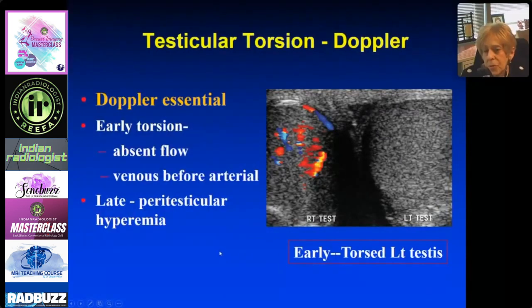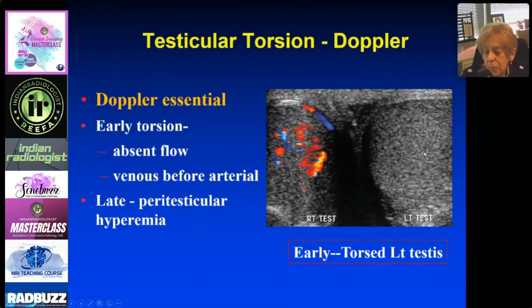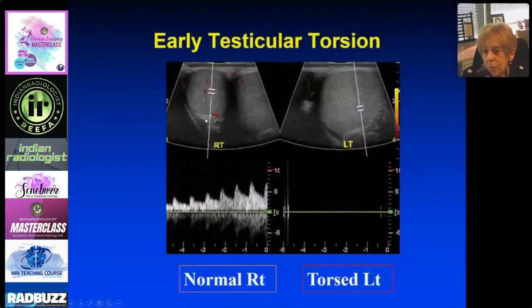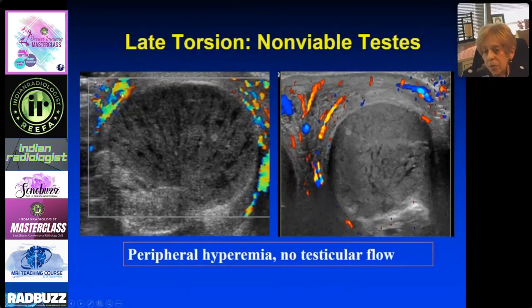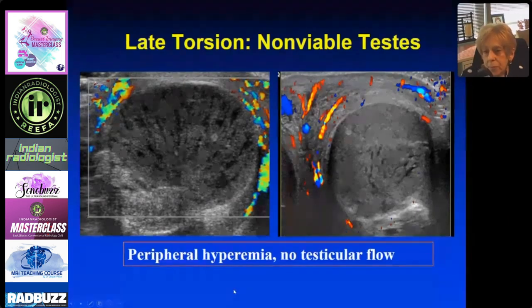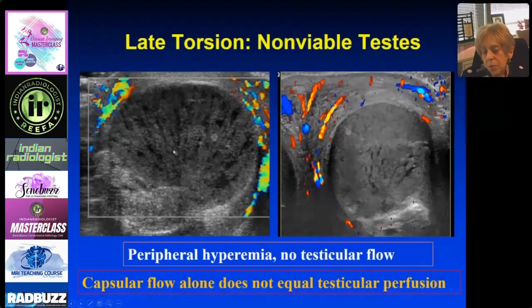Doppler is how you make the diagnosis — it's essential in early torsion when the testis looks normal. You can see absent flow: in a case with both testes looking normal on grayscale, absent flow on one side is early torsion. Venous flow disappears before arterial flow. In late torsion, you'll see a lot of flow in the soft tissues but nothing in the testis. With a large, heterogeneous testis, peripheral flow from cremasteric and deferential vessels does not equal testicular perfusion — you must document flow in the center of the testis.